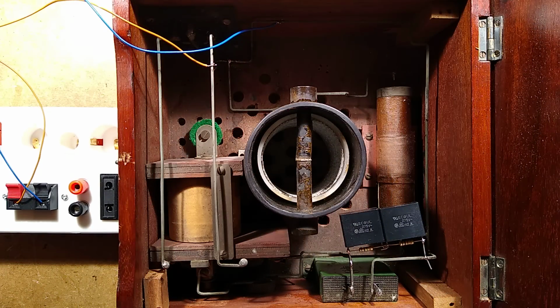Oh, that's a shame. It was worth trying. I thought you might see the purple glow, but it is very faint. The light's about to come back. Watch your eyes. I can smell it. It's stinking of ozone. And if I turn this knob in a bit more, oh, it starts arcing and sparking across.